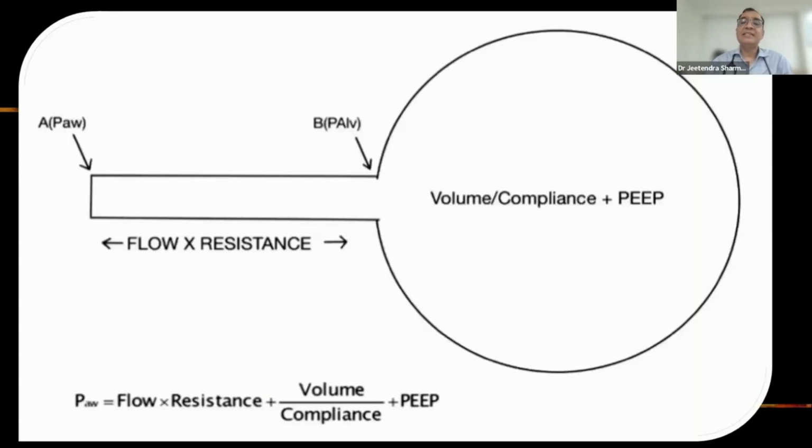And this is an illustrated diagram for a simplified version. That doesn't mean this is one trachea only. We take every tube and just make one tube, just for understanding. In our natural passages, we have the trachea, bronchi, second degree bronchioles, and all these things.